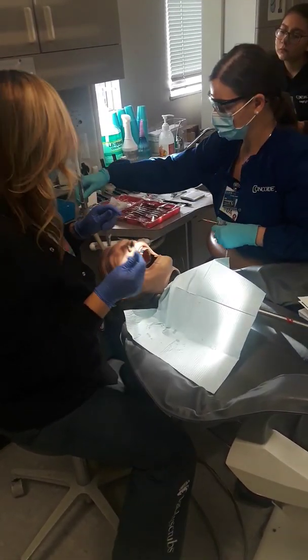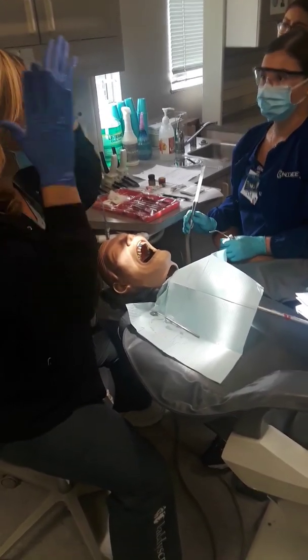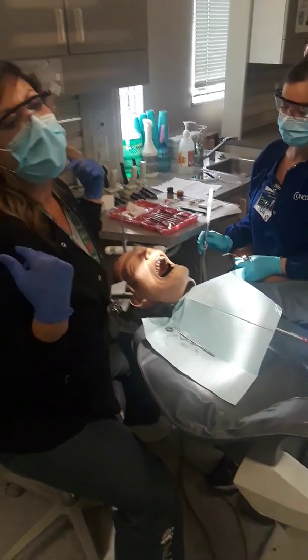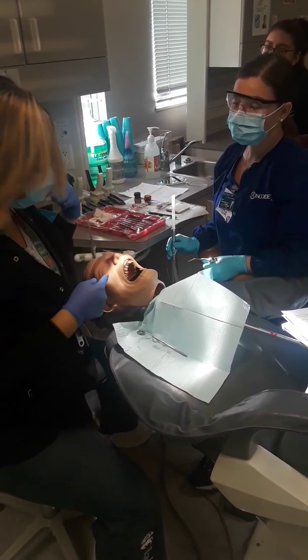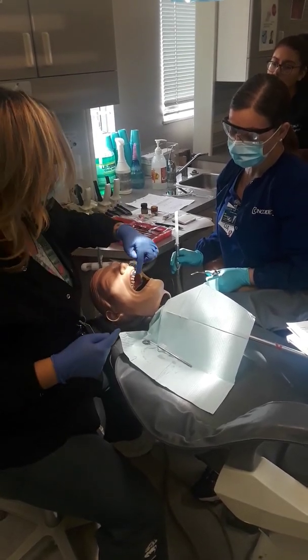So the way I demo this is our patient prep. My head is the prep, my shoulders are the margin. So we want our crown to sit flush with my shoulders. So that's how I refer to a margin. So it's the flat part like the shoulders, and my head is the prep. So that's what that looks like, okay?